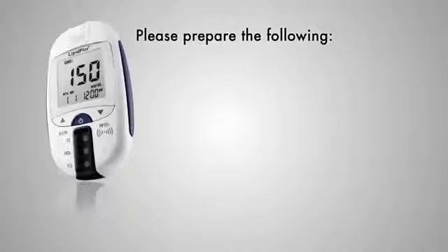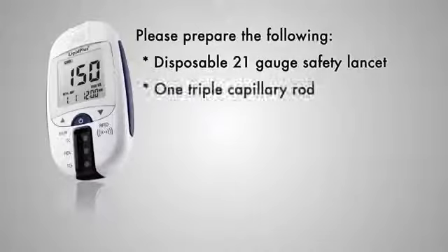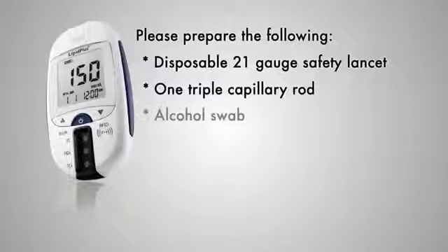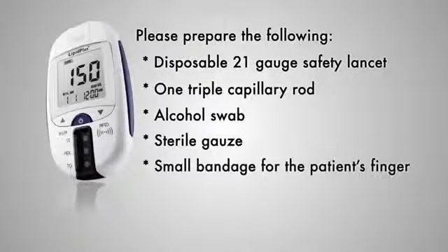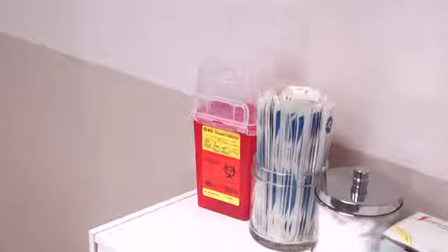Before testing with the LipidPlus cholesterol analyzer, please prepare the following items: disposable 21-gauge safety lancet, 1 triple capillary rod, alcohol swab, sterile gauze, small bandage for the patient's finger, lipid panel strip. As with all testing involving blood, medical gloves should be worn by the healthcare professional administering the test, and a biohazard waste container should be available for disposal of items coming in contact with blood.